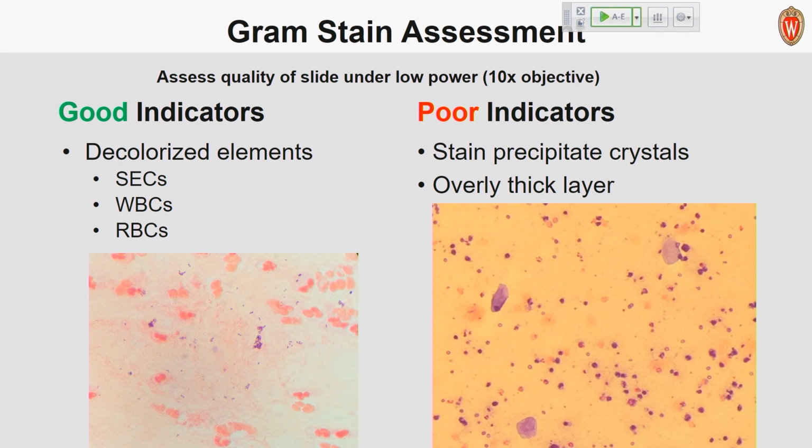If you do urine gram stains, we do urine gram stains because of ICU request. But when you're putting everything into the same staining protocol, you're going to get some variation in the amount of methanol being applied to the stain and the decolorizing agent, and how that's working. So overall, you're assessing that gram stain at the 10x objective.